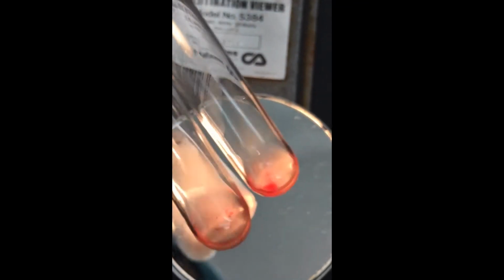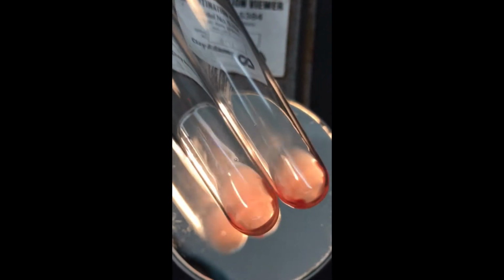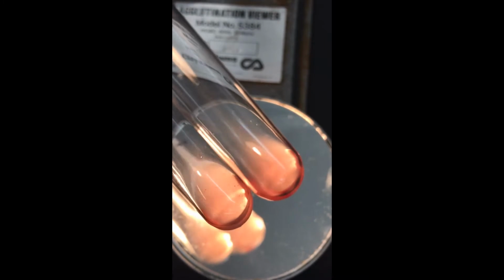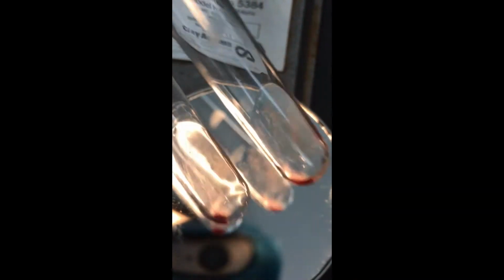Okay, this is sample C, after 37 degrees incubation with LISS, tubes 1 and 2. Tube 1 is on the bottom and tube 2 is on the top or the right. Tube 1 is on the left or the bottom. Tube 3 and 4.